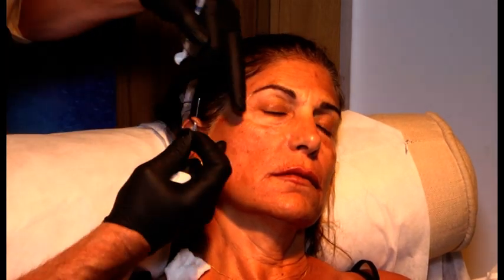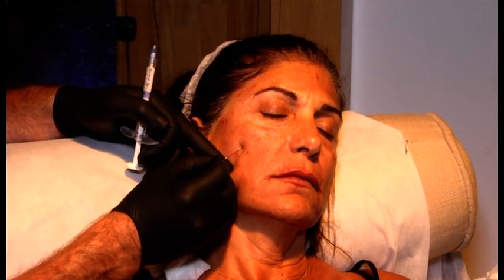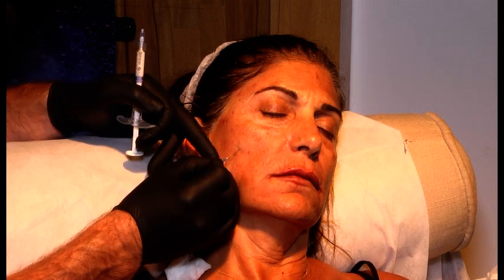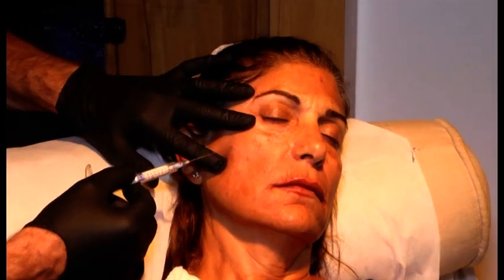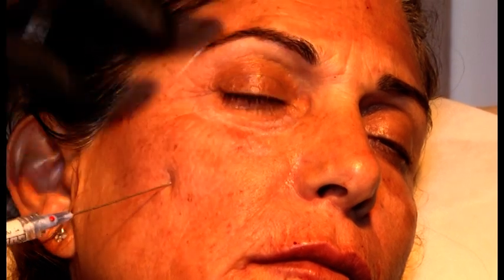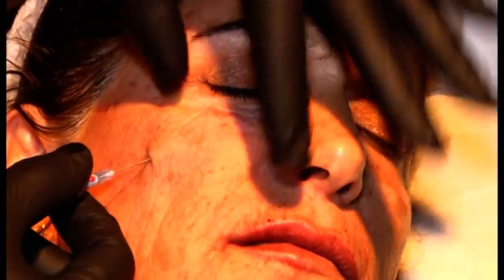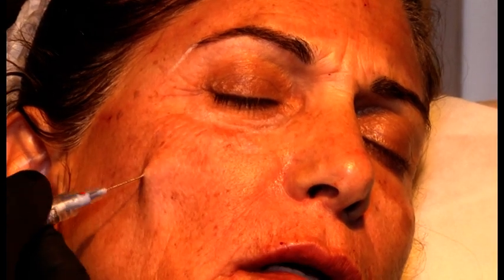So the second entry point is at the lower border of the zygoma, approximately at the lateral orbital rim. From here, again, I can go submus, click, in between the two ligaments.